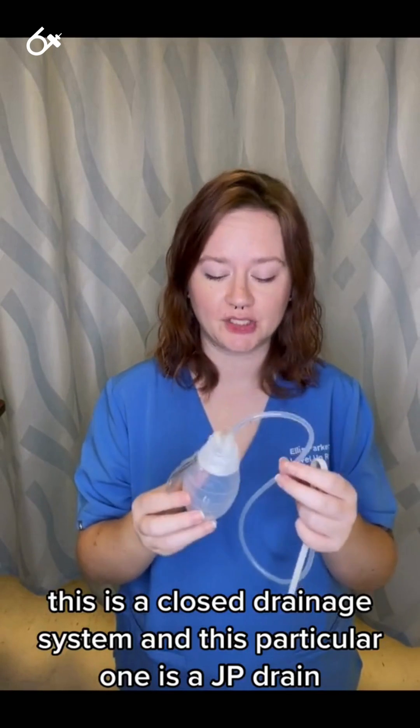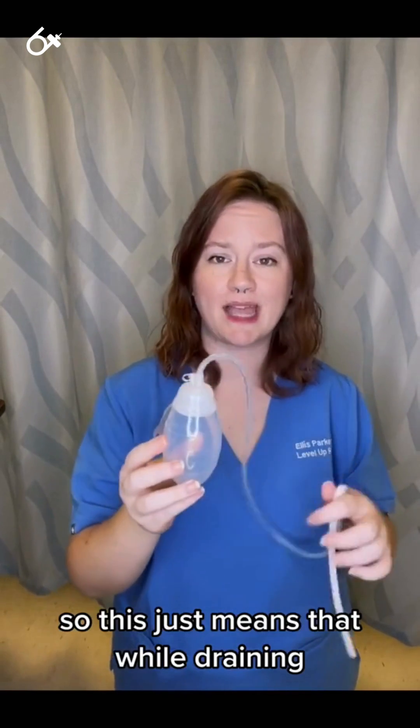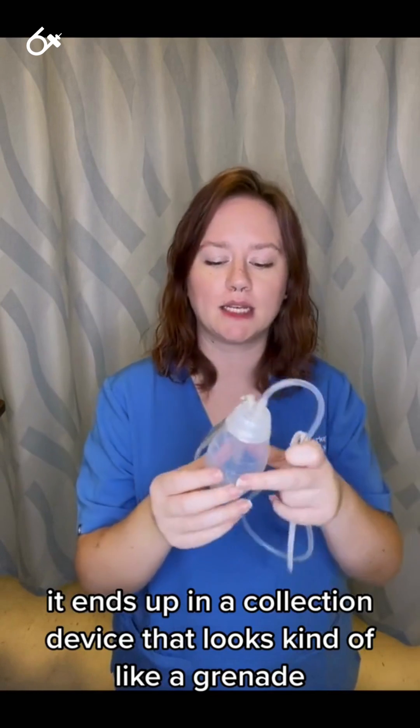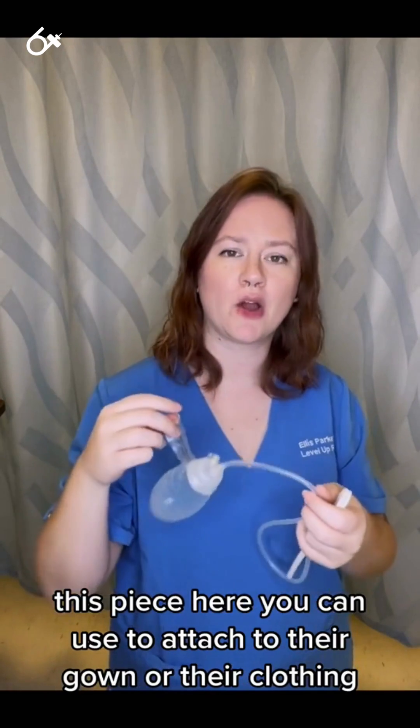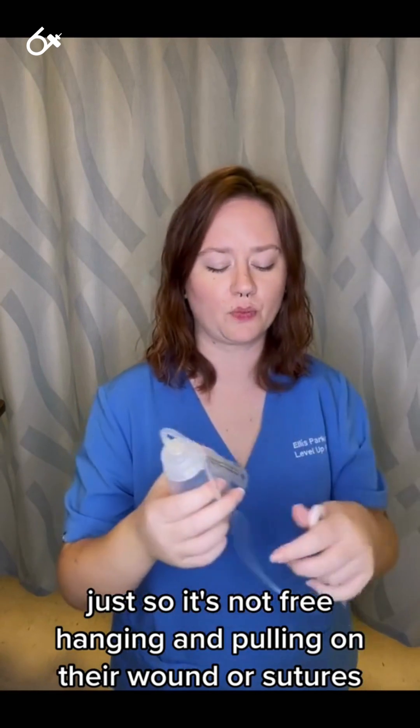This is a closed drainage system, and this particular one is a JP drain. This just means that while draining, it ends up in this collection device that looks kind of like a grenade. This piece here you can use to attach to their gown or their clothing, so it's not free hanging and pulling on their wound or sutures.